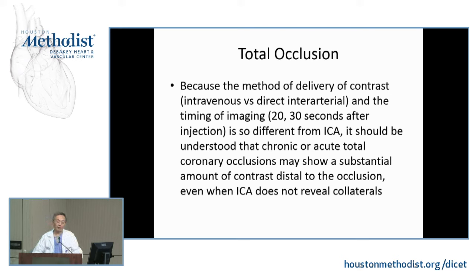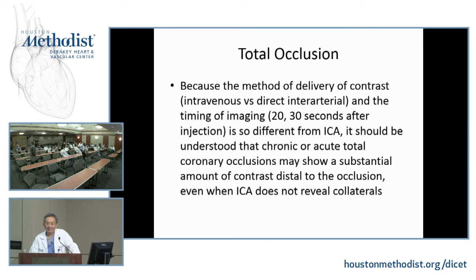For the fellows who have gone to the cath lab, how does the coronary look when you give 50 cc of contrast in the aorta? Anybody? Fahim? Dr. Not great. Just think about it for a second.